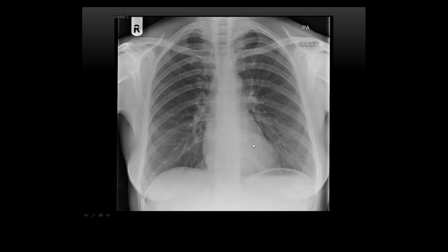But as I become more and more confident, it changes. So like I said, even if you guys use the ABC method at the moment and you decide, actually, I find it this way easier, just change it. As long as you use that same method every single time.